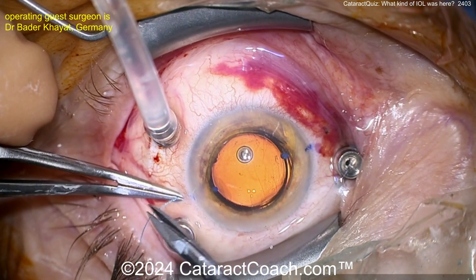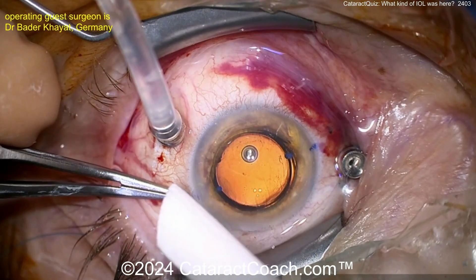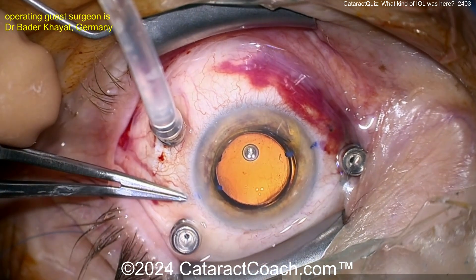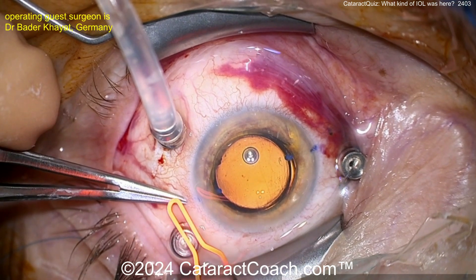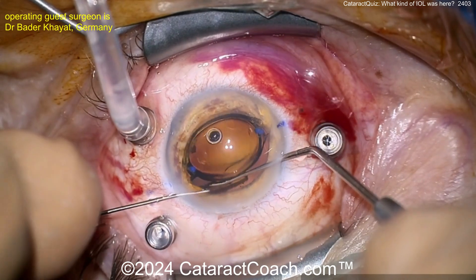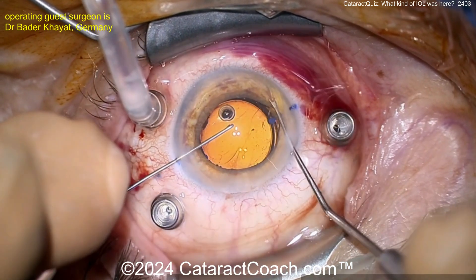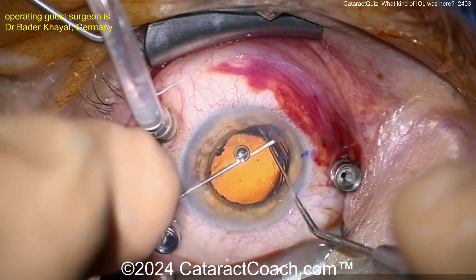When you do these lens calculations, assume in-the-bag power — but I'd also add at least a half to one diopter, because this lens sits a little more posterior than you're anticipating. If the effective lens position is a little more posterior, a little closer to the retina, you need a little bit higher power. Plus, it's always a benefit to have a little bit of myopia. Now there are the haptics being tucked in — nice and easy. Very interesting technique; I have not seen this before.